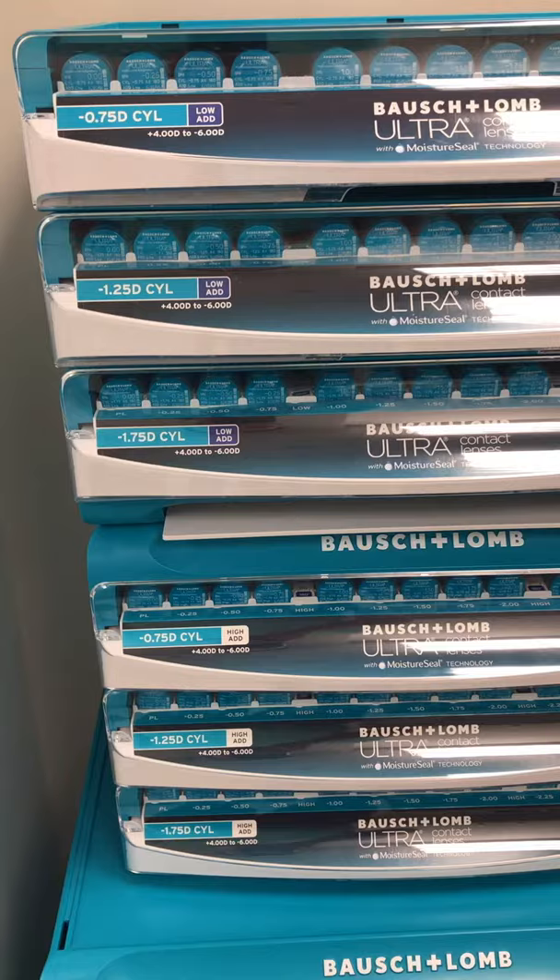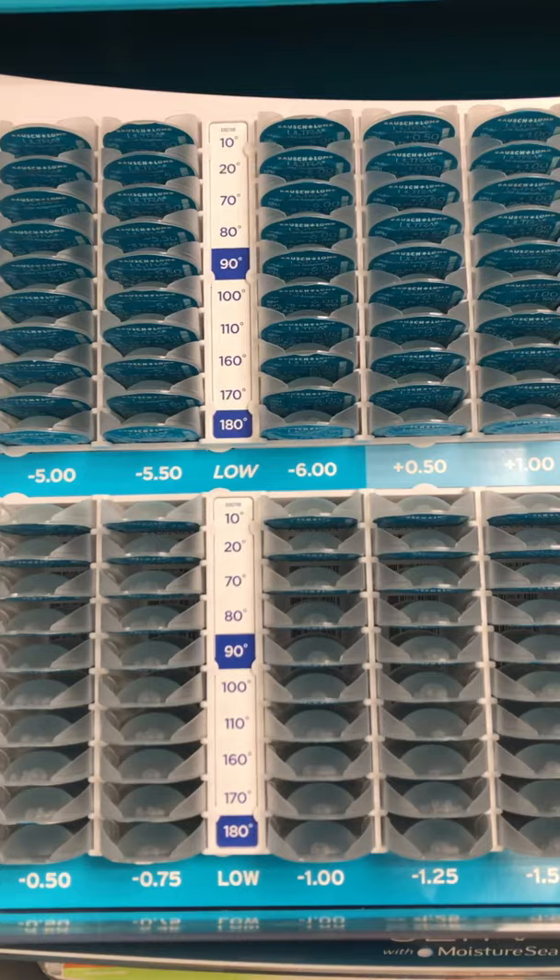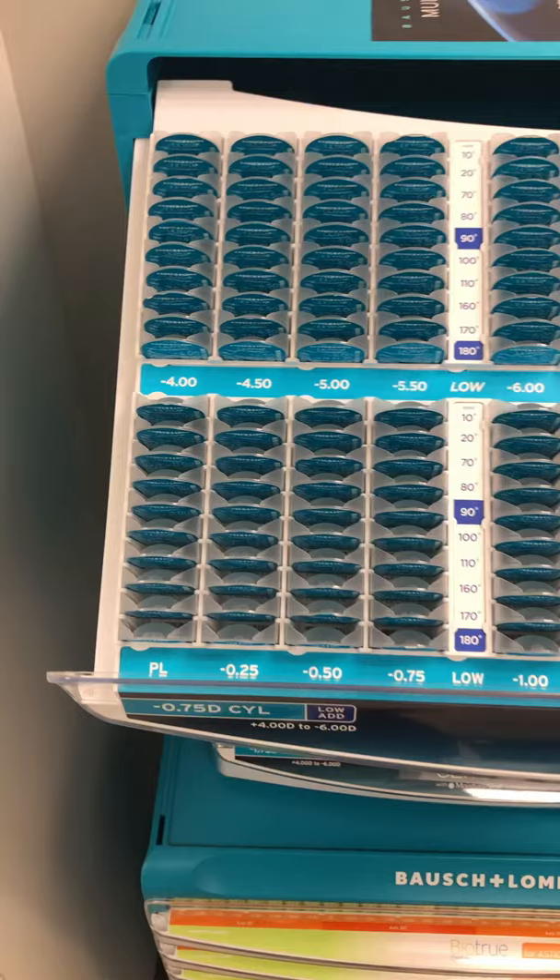If you pull things out here, you'll see that the in-office set comes with axes at 10, 20, 70, 80, 90, 100, 110, 160, 170, and 180 degrees. It comes from Plano all the way over to plus 4, and all the way up to minus 6.